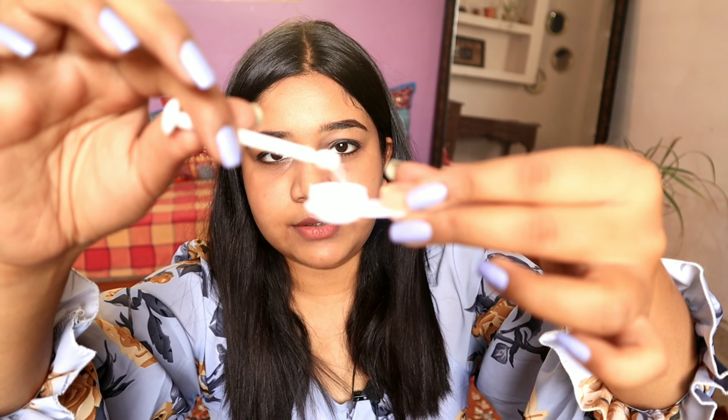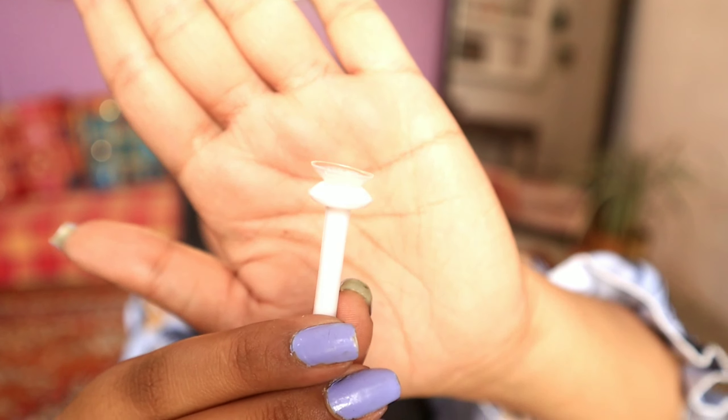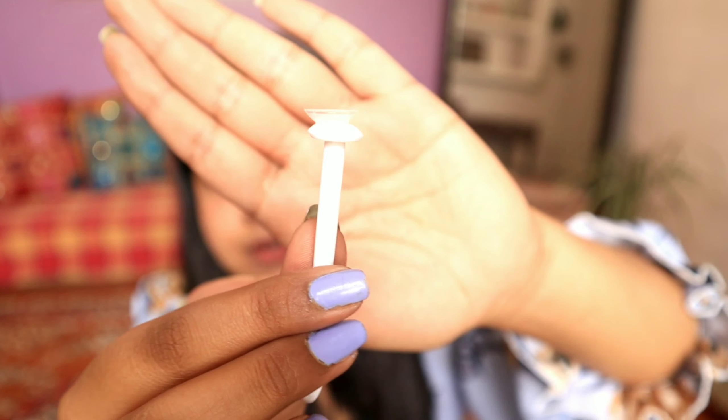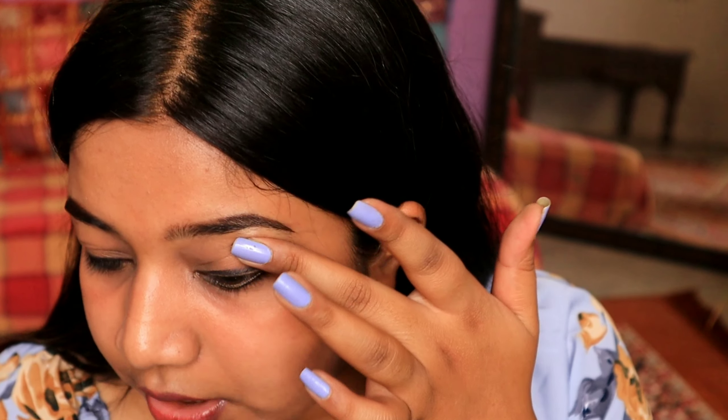I'm dipping the applicator in to remove the lens. Now I have to check whether the lens is the right way or inside out — if the edges flare outward it means the lens is inside out, and if it forms a bowl shape it is correct. Let me see if our lens is the right way. It looks completely right. I'm going to place the lens on the white portion of my eye and try to keep it there.